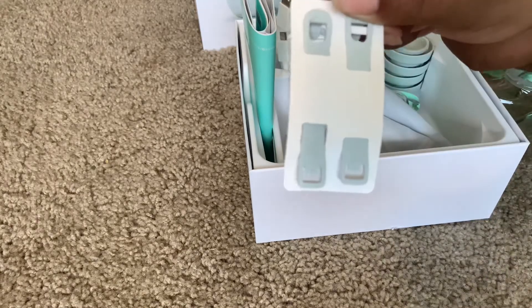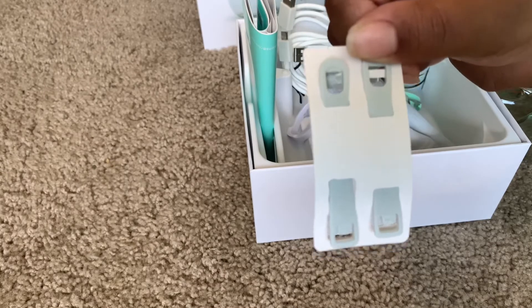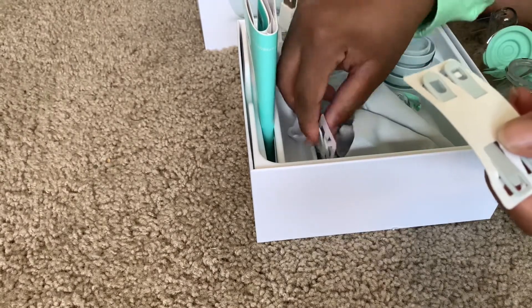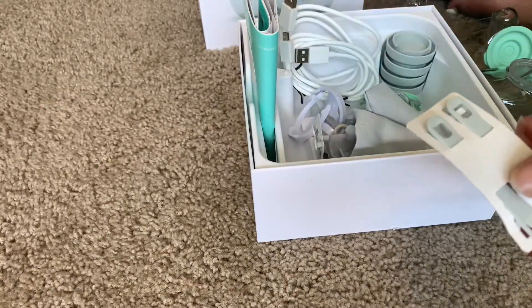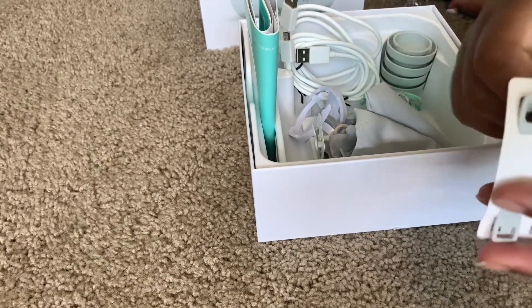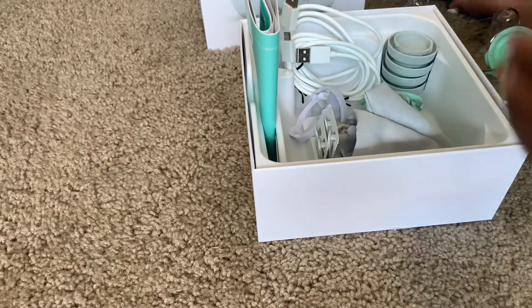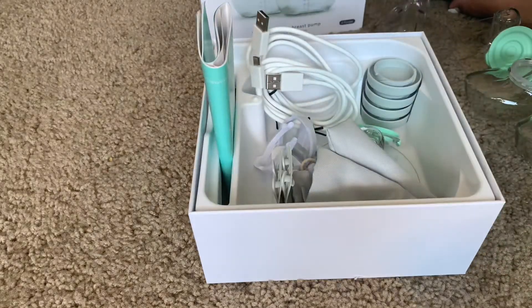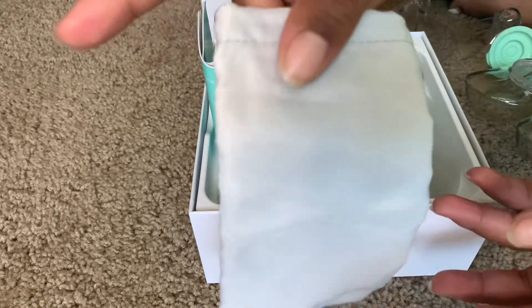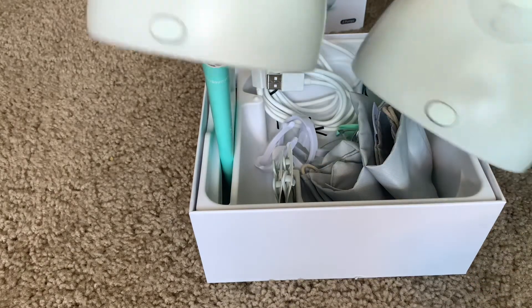They also include these really convenient attachment clips. The thing about the Elvie is it has to be completely attached to your body — there cannot be any gaps between the pump and your breast. These clips attach to your bra to make sure it's very sturdy, because the Elvie will not work if it's not perfectly attached. They also include storage bags to transport the Elvie with you, and then here is the actual pump itself.